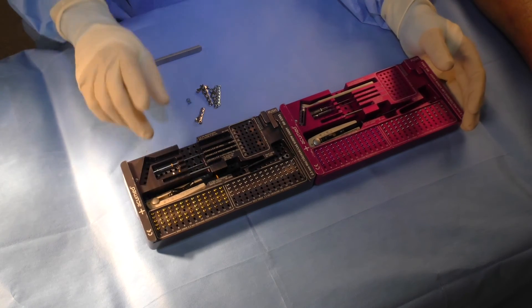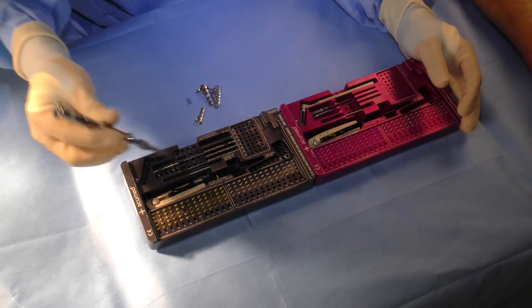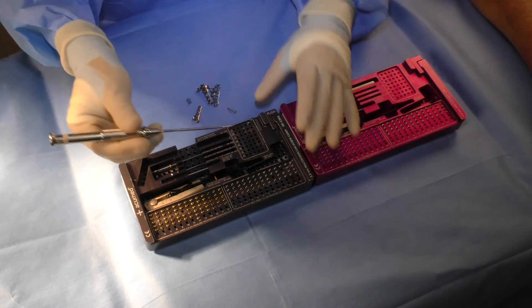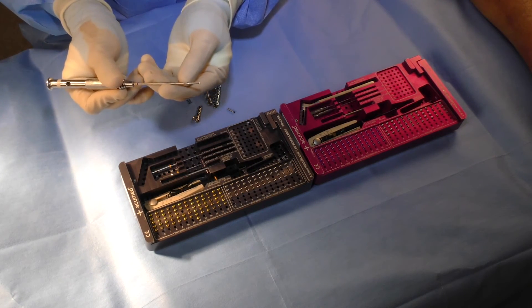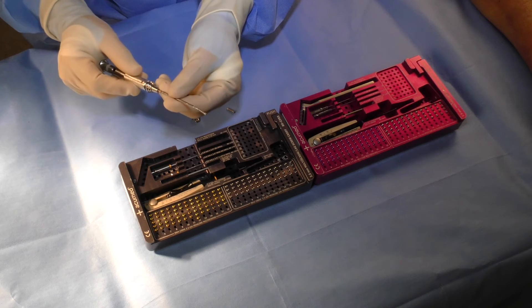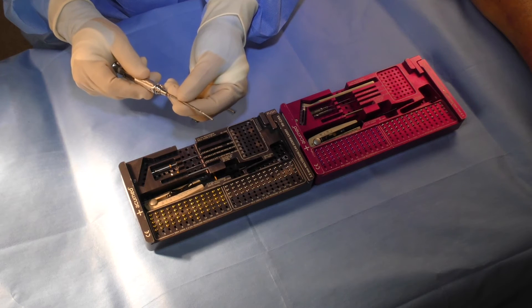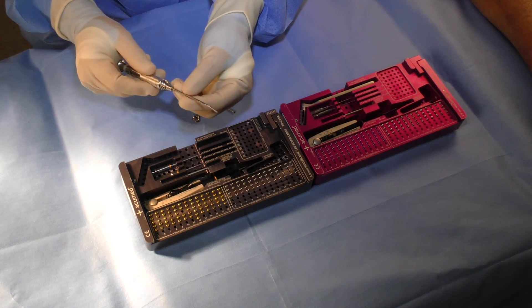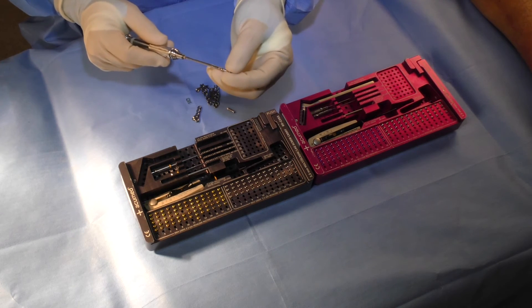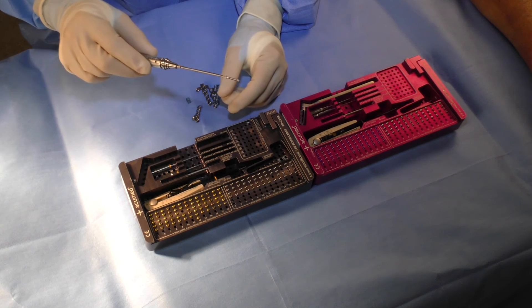For each screw size there are two screw types: locking screws, which have threads on the head, and lag screws. The lag screws are designed without any threads in the head, and the first three millimeters of the screw are non-threaded. This allows inter-fragmentary compression across an oblique fracture without having to over-drill the near cortex, removing an extra step and avoiding the risk of comminution near the fracture. The lag screw can also be used as the initial screw of a plate placement to compress the plate against the bone if needed.